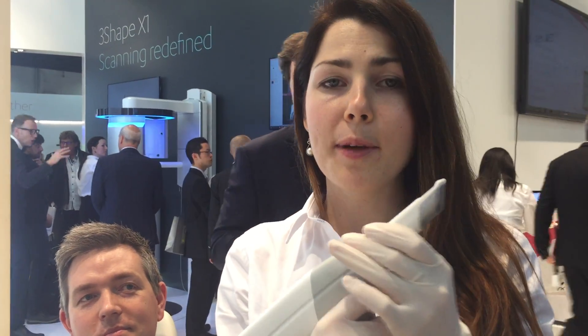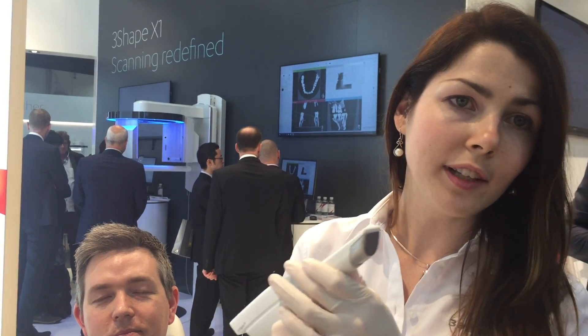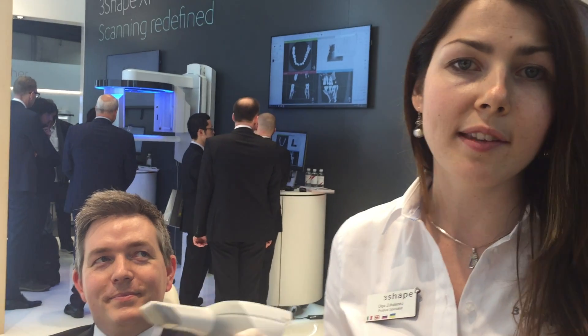Now I just flip around the tip. The tip can be removed and it can be put in the autoclave to sterilize it between one patient and another. So now we are ready to scan the upper jaw.